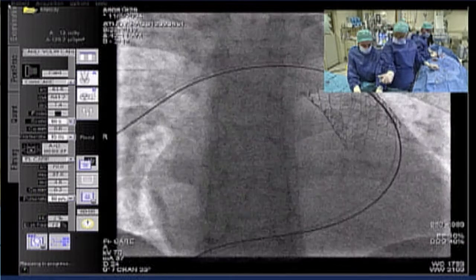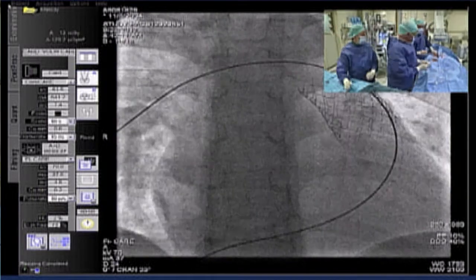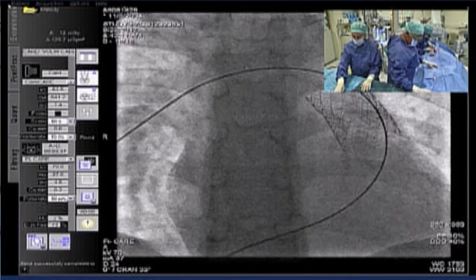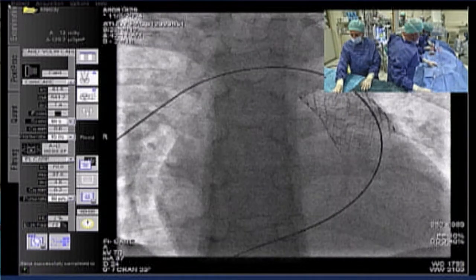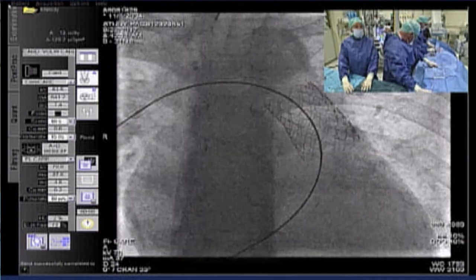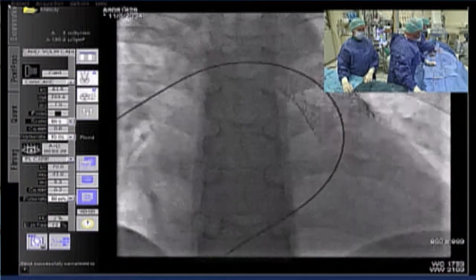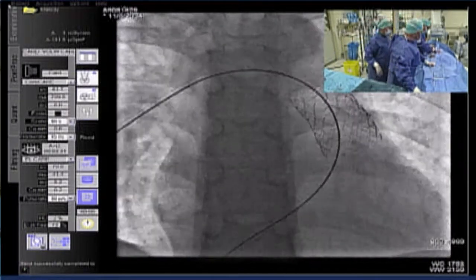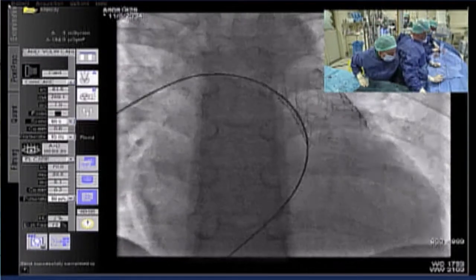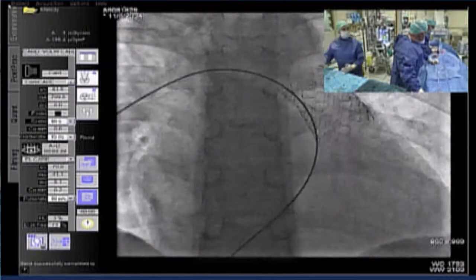What size sheath, Mark, do you have in the groin? You said 24. No, we have no sheath. We enter the ensemble with its own sheath. You're gonna go through the skin. Yes. That's probably why he's feeling it. I usually give Marcaine at the beginning of the procedure, which is a long-acting xylocaine that helps these patients. Now you can see he's a bit tachycardic.